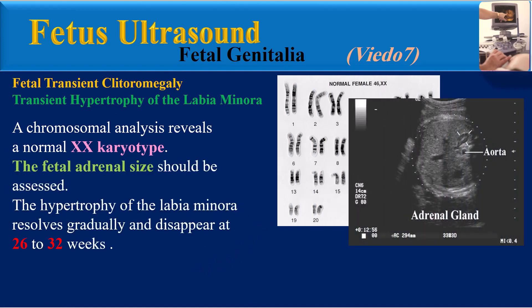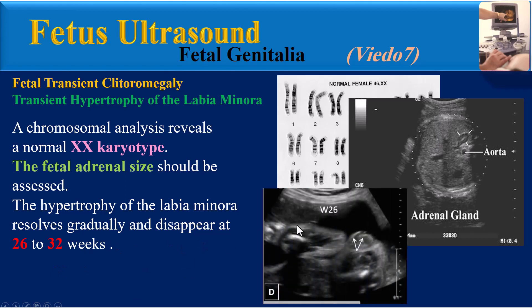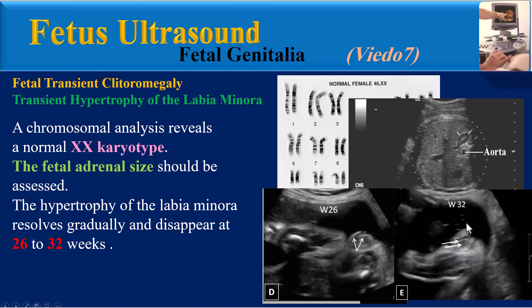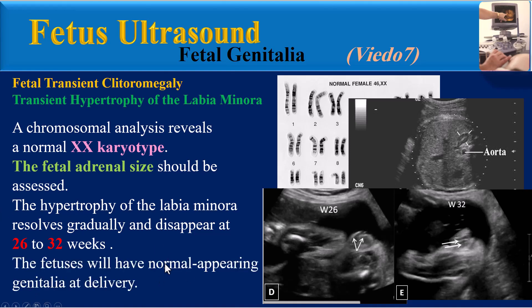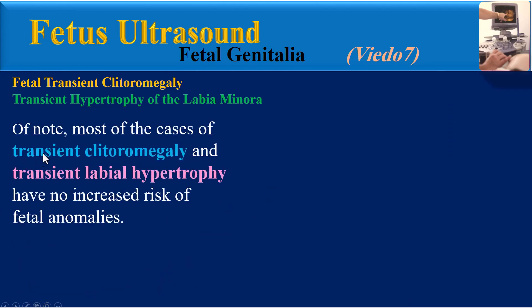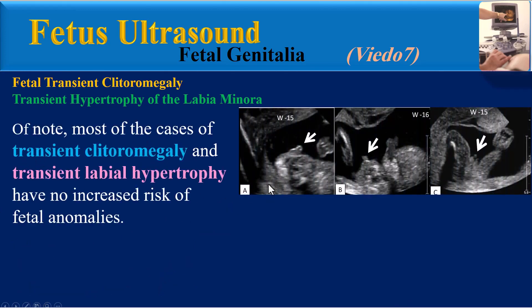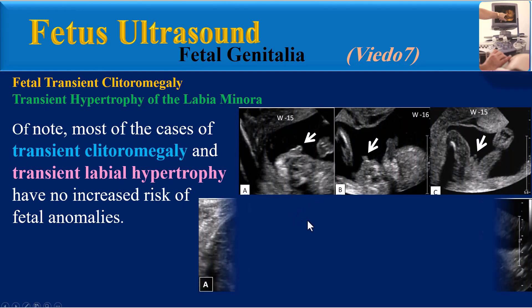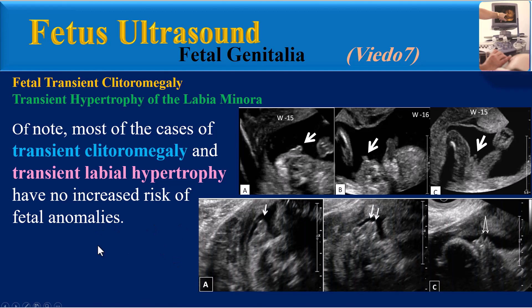Chromosomal analysis reveals a normal XX karyotype. The fetal adrenal size should be assessed. The hypertrophy of the labia minora resolves gradually and disappears at 26 to 32 weeks. This image from the same fetus at 26 weeks gestation shows normal appearing labia, and at 32 weeks we can see normal appearing female external genitalia with a triple line appearance. The fetuses will have normal appearing genitalia at delivery.